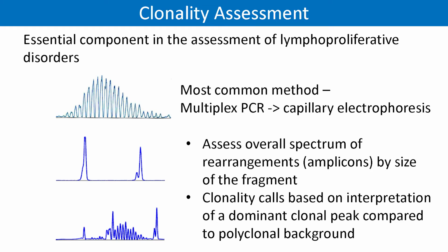As you know, clonality testing is an essential component of the assessment of lymphoproliferative disorders, and historically this has been done for many years using the most common method, multiplex PCR with capillary electrophoresis, which gives you an idea of the arrangement or the overall spectrum of rearrangements by the size of the fragment, but doesn't really give you information on the actual sequence of the clone.